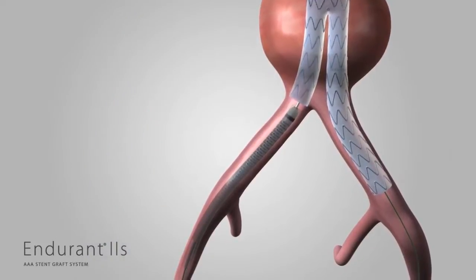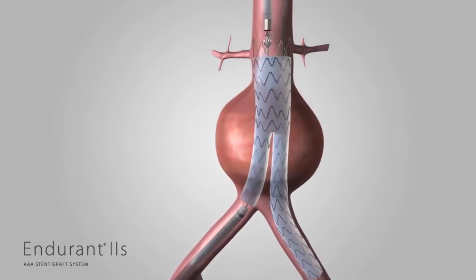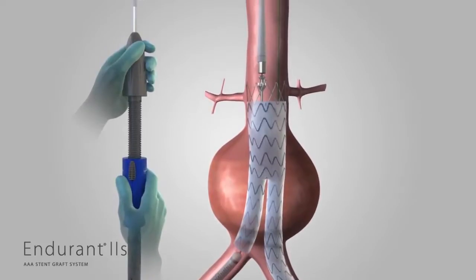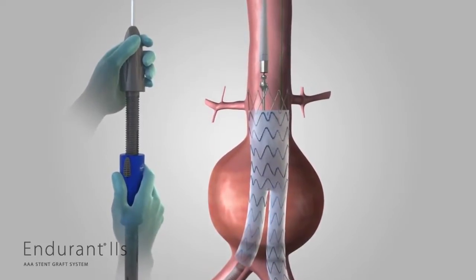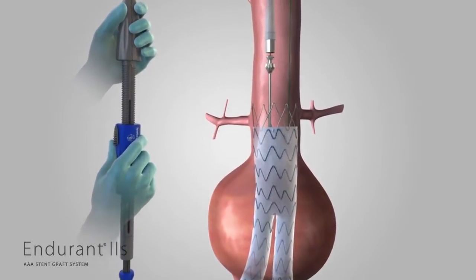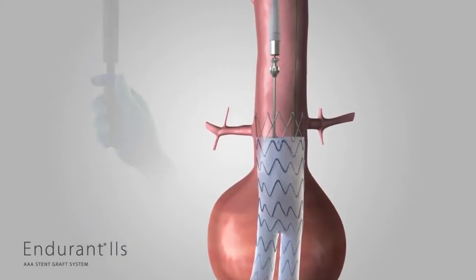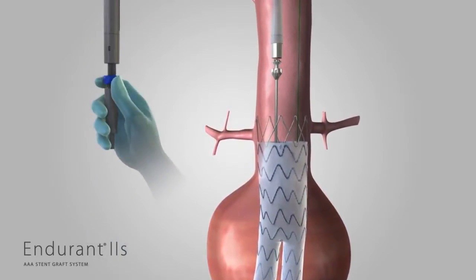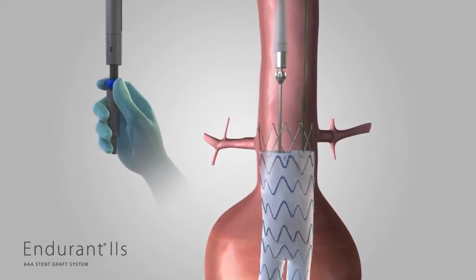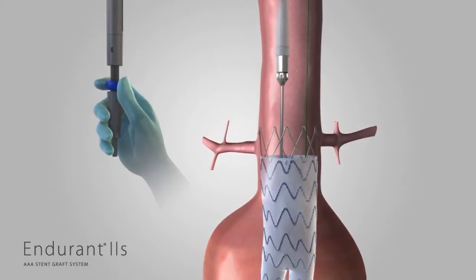The tapered tip of the aortic delivery system needs to be recaptured before removing the delivery system. Gently torque and push the entire delivery system in a cranial direction using a counterclockwise motion, approximately three centimeters, so that the tapered tip and spindle are completely clear of the suprarenal stent. Then, rotate the back end wheel counterclockwise in the opposite direction of the arrows until the spindle has been completely recaptured in the tapered tip and the back end wheel has been returned to the bottom of the back end screw gear.